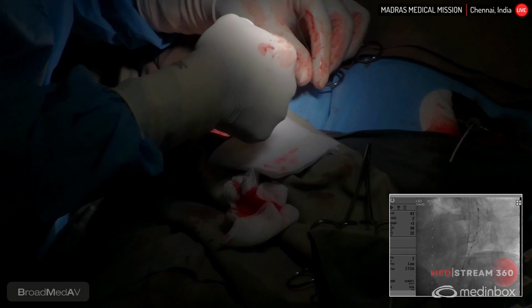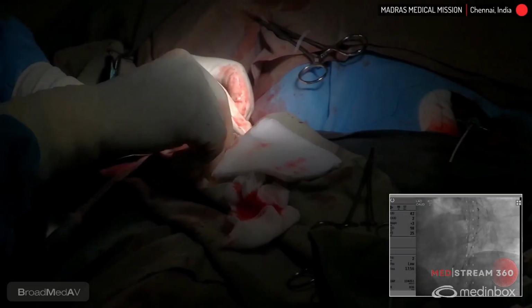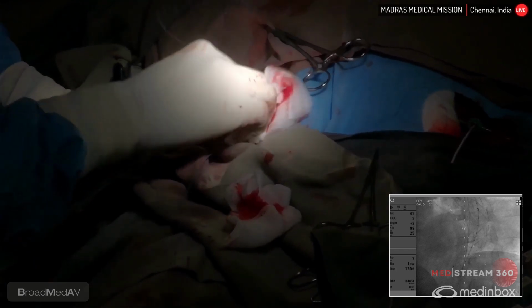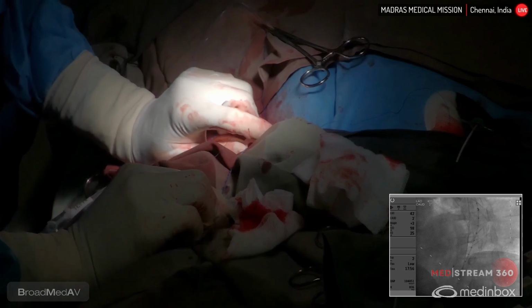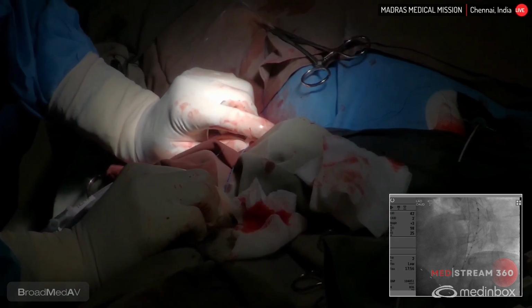Normally, when you close with closure devices, you have 20% narrowing of the vessel. So in a big vessel, you can accept it. In a small vessel, it might be difficult to accept. So then I would go for 2 ProGlides. First, I would like to remove the stiff wire out of this device. So Ashish, can you take a JR, bring this stiff wire out, and we can exchange it to a 035 regular wire.